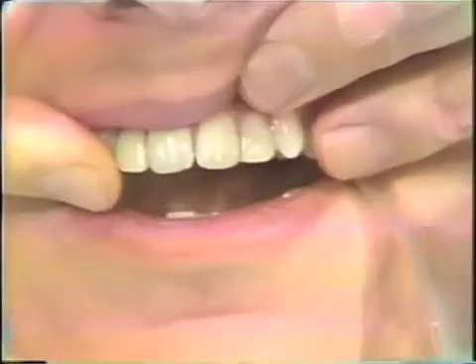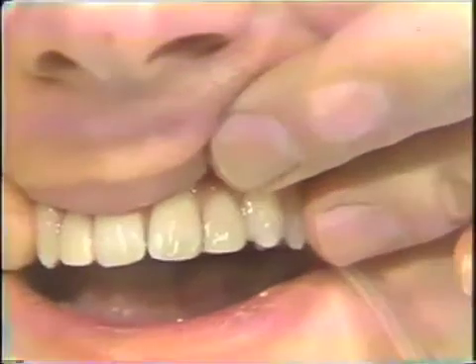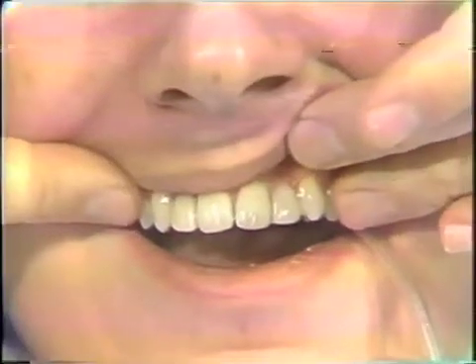However, if the case is designed properly the gold does not show from an anterior view. You'll note the pontic design — it's a very aesthetic looking case that will give the patient many years of good service.